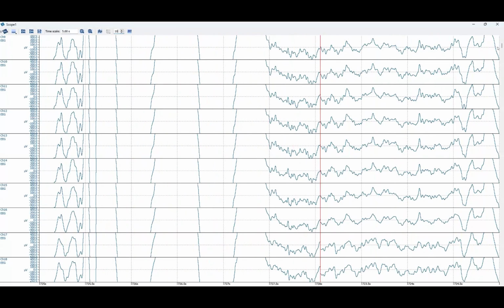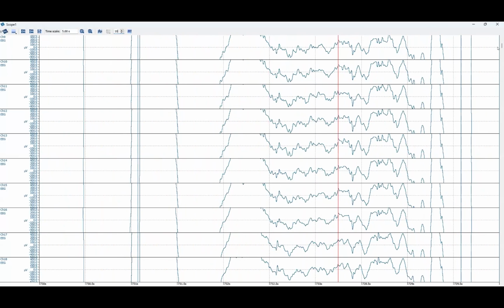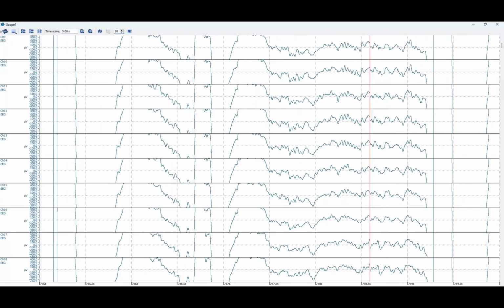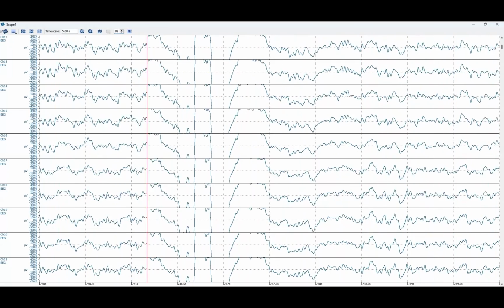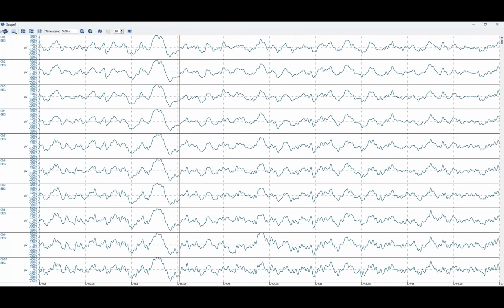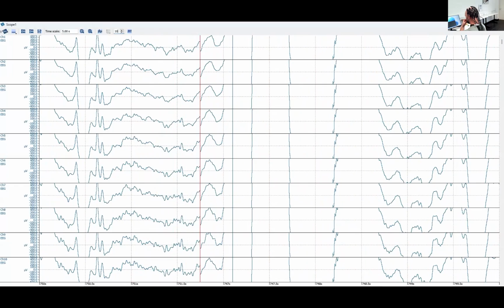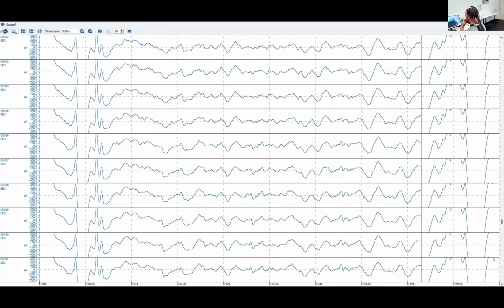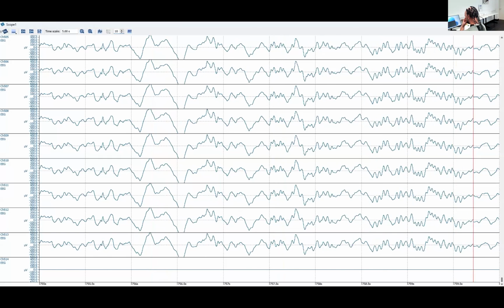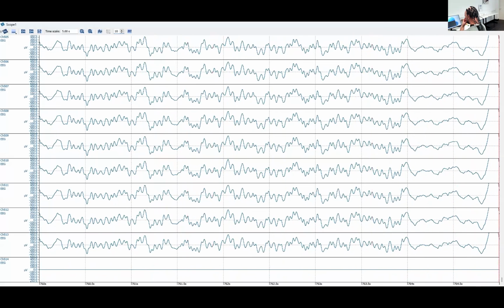Now you can see how clean the EEG data actually looks like. So it's beautiful EEG, and only when Leo is touching it, of course, then we get these fluctuations because he's charged up electrostatically, and then we have also the movements of the electrodes. So which electrode is now? So this should be actually on the back. So I remember the last grid was, but we are doing already a common average over that and with the bad channel excluded. So it's a bit hard to see that exactly now, actually.